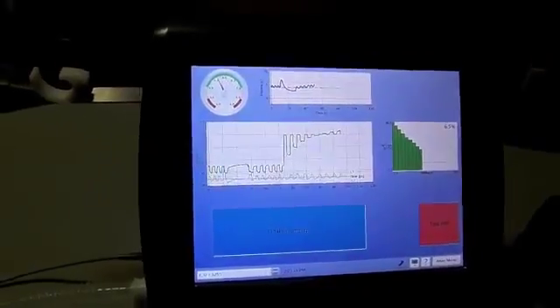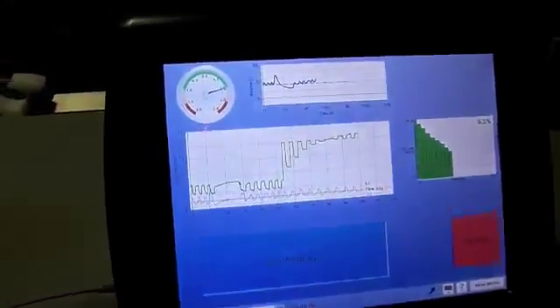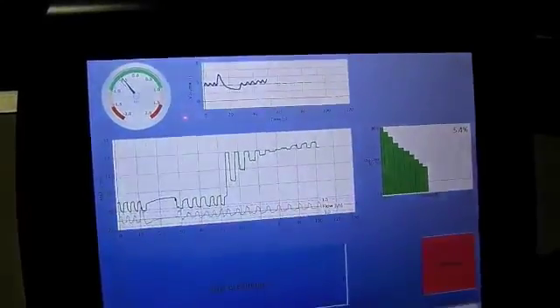We try to achieve less than 2%. We'll have to do multiple breaths under 2% for the test.